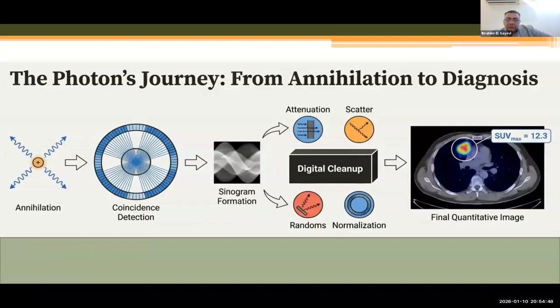For the event classification, we have explained the true events, accurate localization; the scattered event, mislocalization; random event, noise; multiple event, mislocalization. Correction is essential. Essential to what? To maximize the true events in reconstruction.